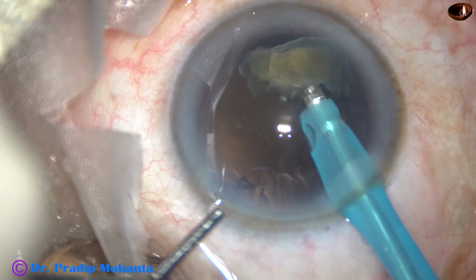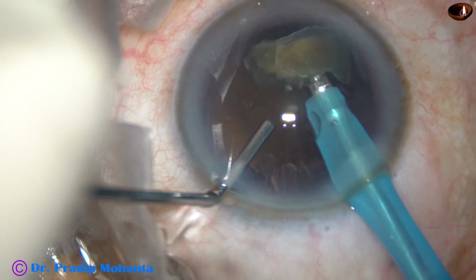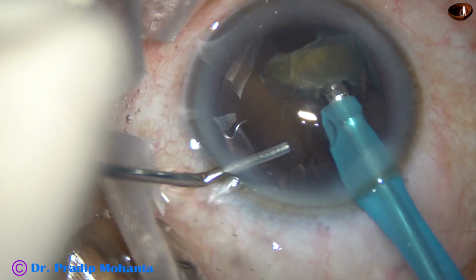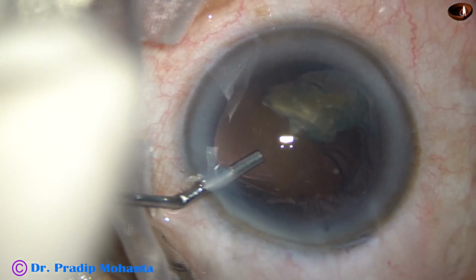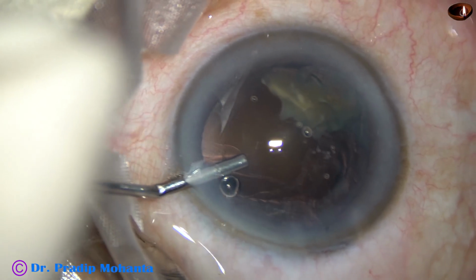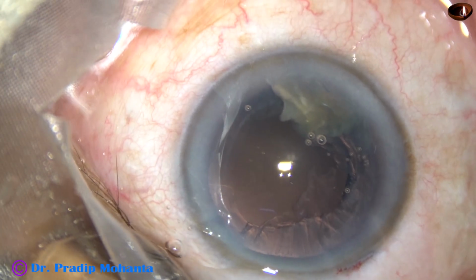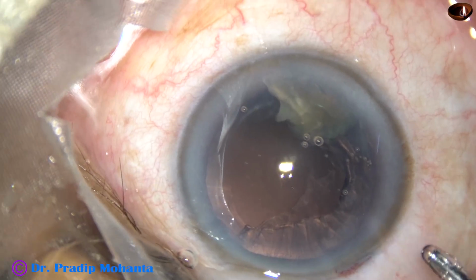Otherwise the rent may enlarge and I'll have very big problems. So I stop irrigation, ask the assistant to inject visco, and it is done. There is no vitreous prolapse and there is a very small rent.